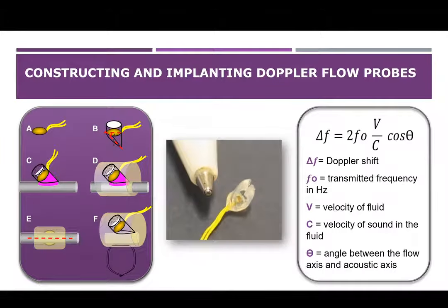And so I'm very lucky. I have a fantastic senior research technician who actually helps us. And in the past, she's constructed all of our probes almost from scratch. So we receive the crystal attached to the wires, and she actually makes our probes for us so that they sit at a 45-degree angle to the vessel.